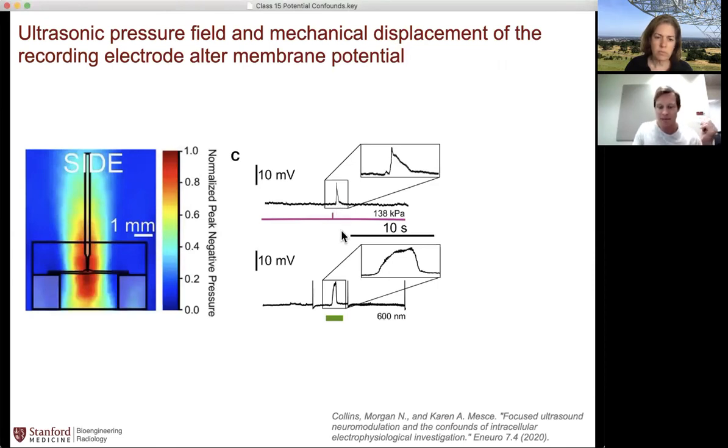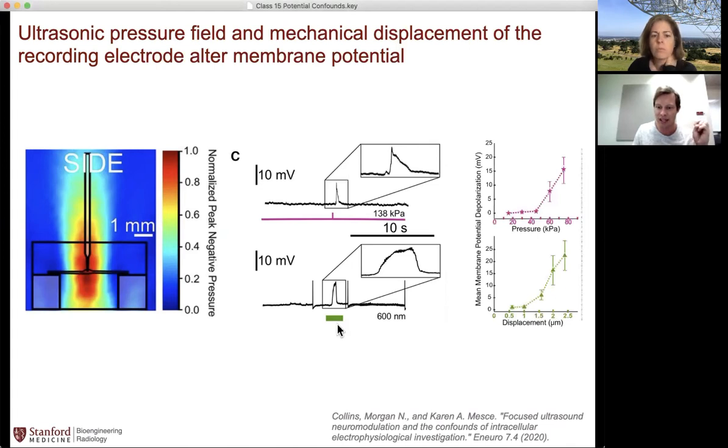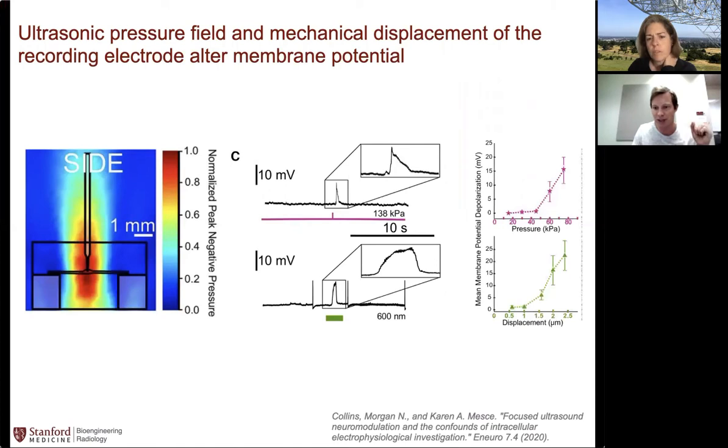Now below that, they're taking the micromanipulator, which holds the electrode, and simply moving it up and down within the prep. And they're not identical. You can see there's sort of a slower onset, but what you can see is that both of these manipulations will give you a deflection in this electrical activity. And if you hit next here, Kim, you can see a quantification of that. So they were able to measure across different amounts of pressure delivered, and you can see that the cell is depolarizing, and they were able to mimic that by displacing the electrode.